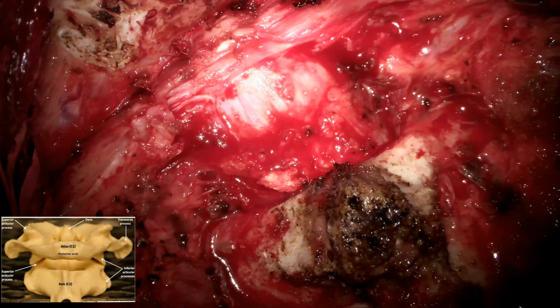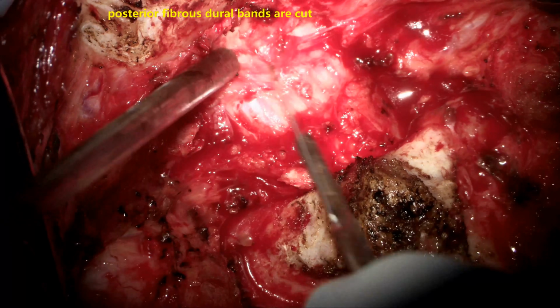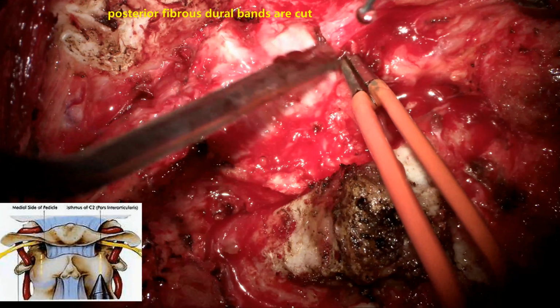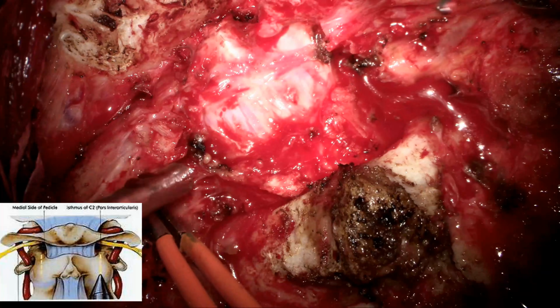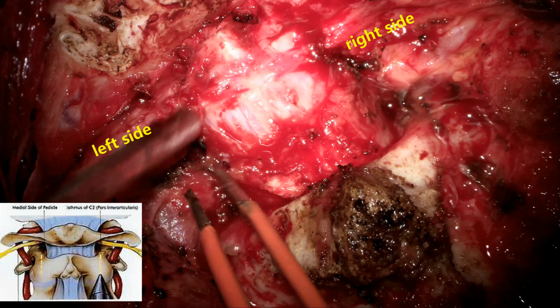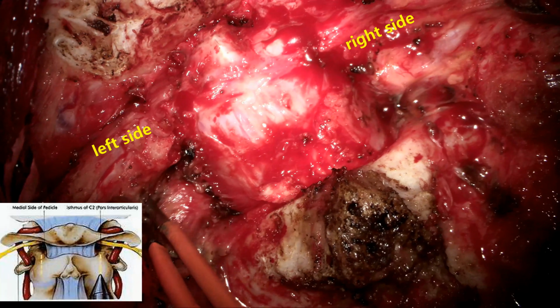The soft tissues are released with sharp dissection. Usually in these cases, there will be fibrous adhesion bands on the dura mater at that juncture, which need to be cut so the dura is released. Now you can see the right side and left side. We have exposed the C2 nerve root with the ganglion.